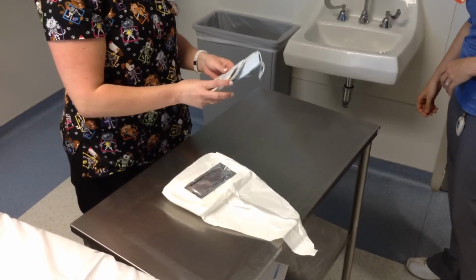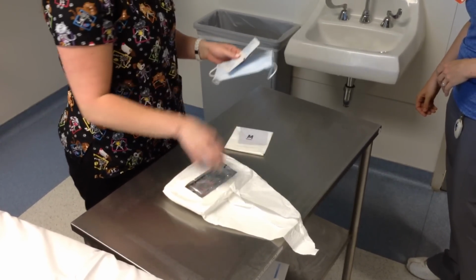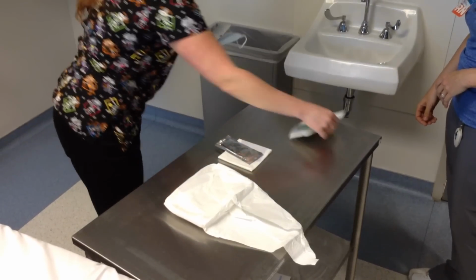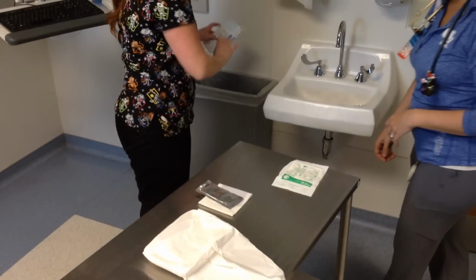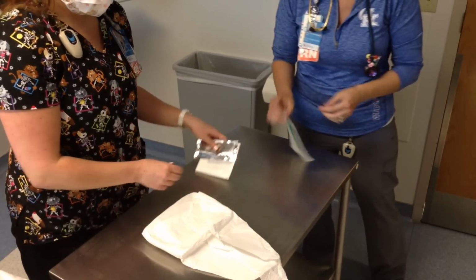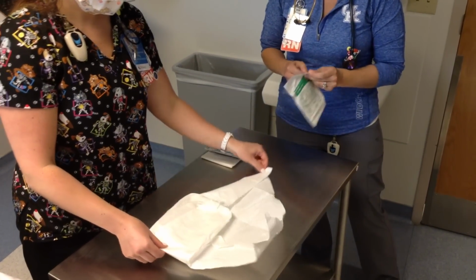Throw the mask away if you're not going to use it. I already have a mask on, so I will not use it. Unfold the remaining flaps of the kit away from your body using the 1-inch border around the edge. So be careful only to touch the 1-inch border along the edge.